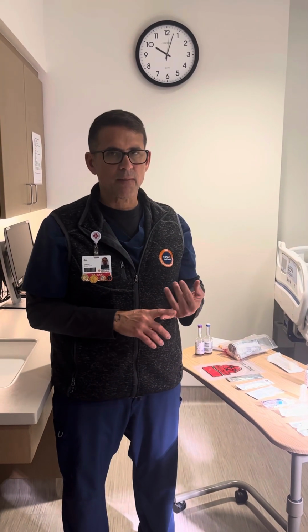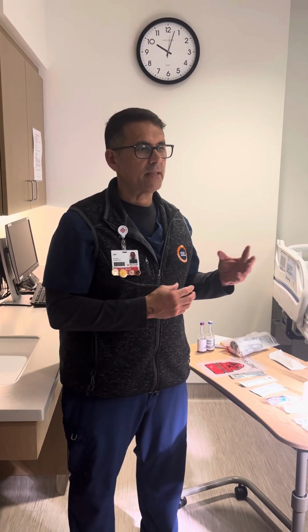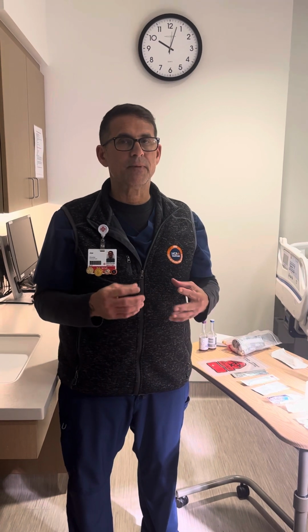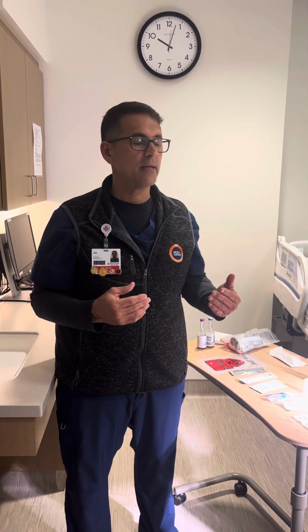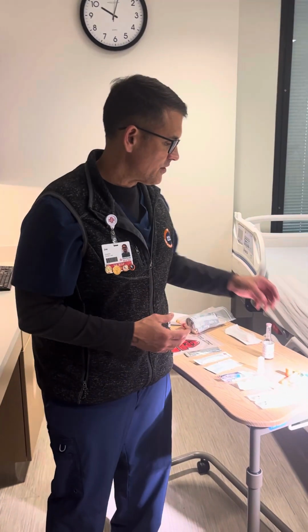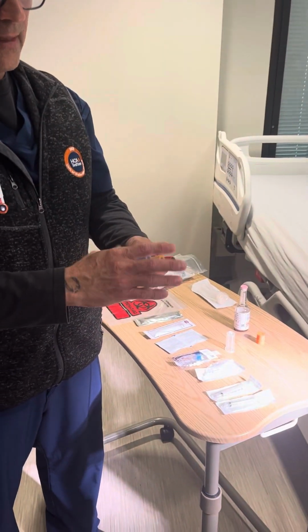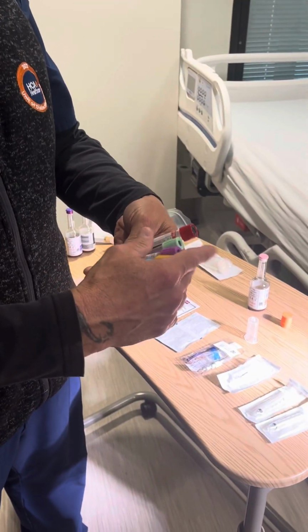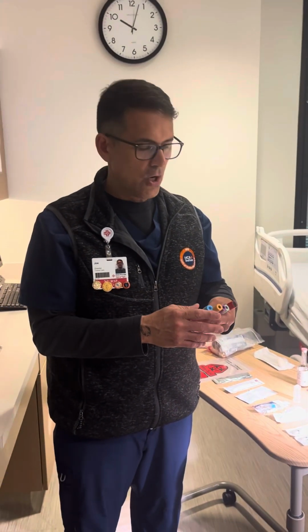A lot of the things we talk about here are things that some people might do a little bit differently. There's room for people having their own way of doing some things, but there are others where there's no room, and I'll try to go over some of those. So first of all, these are our most common lab tubes, and a lot of times I hear people say, "Oh, I drew a CBC, but it was hemolyzed," or "I drew a chemistry and it clotted."